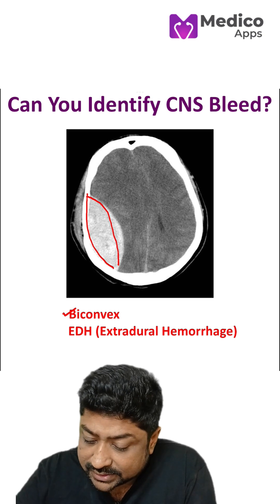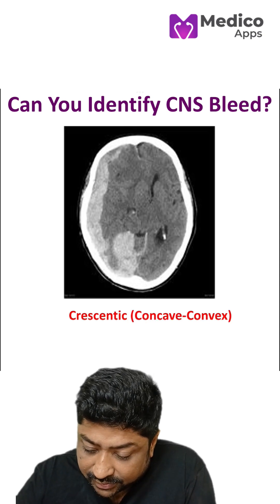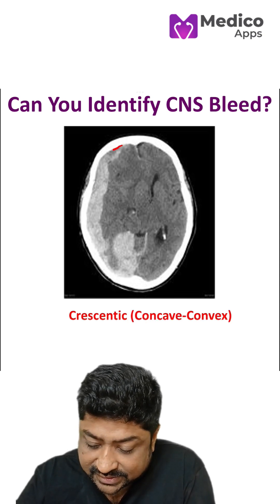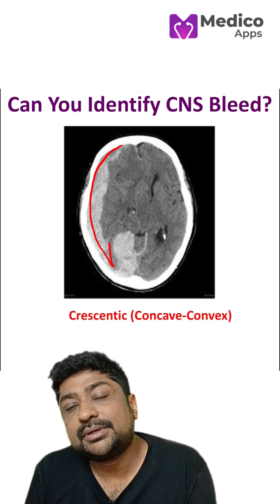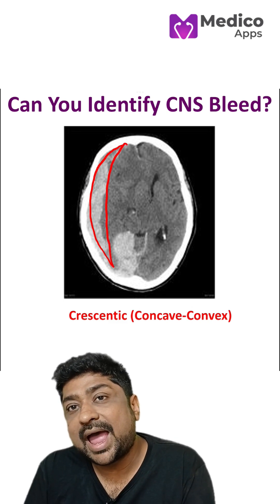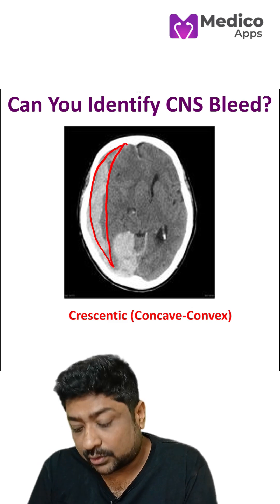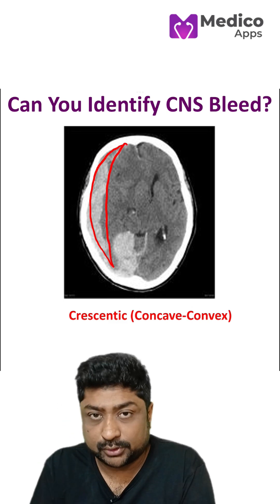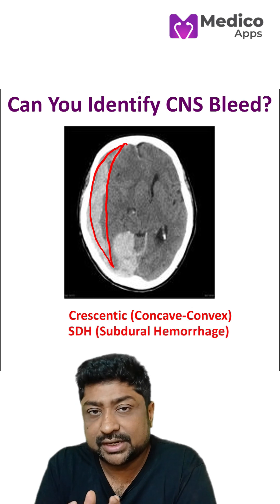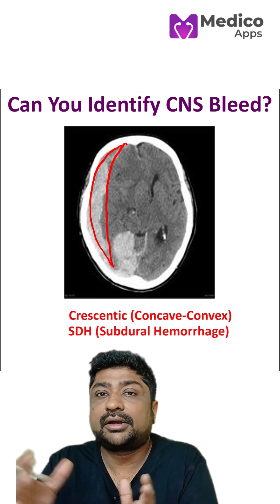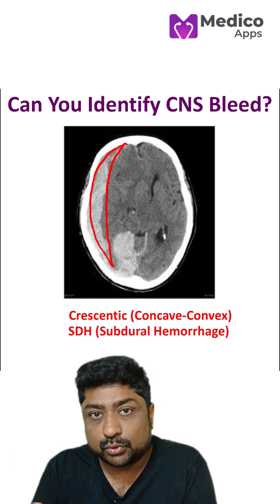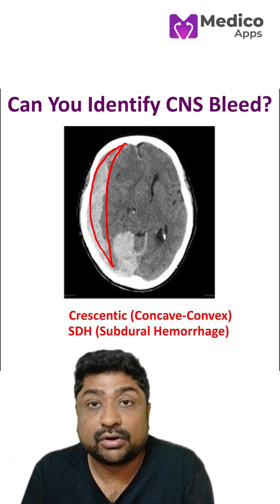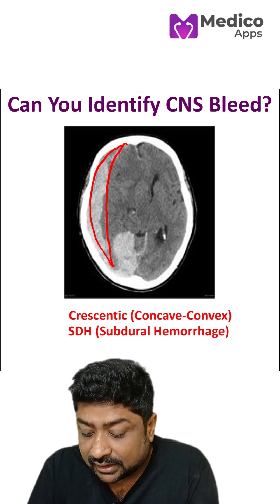Let's look at another case. Here we can see it's a crescentic bleed. This bleed happens between the dura and the arachnoid, and it is called subdural hemorrhage. Because it is loosely adhered, the blood can spread a little more — that's why you have a crescentic or concavo-convex bleed.